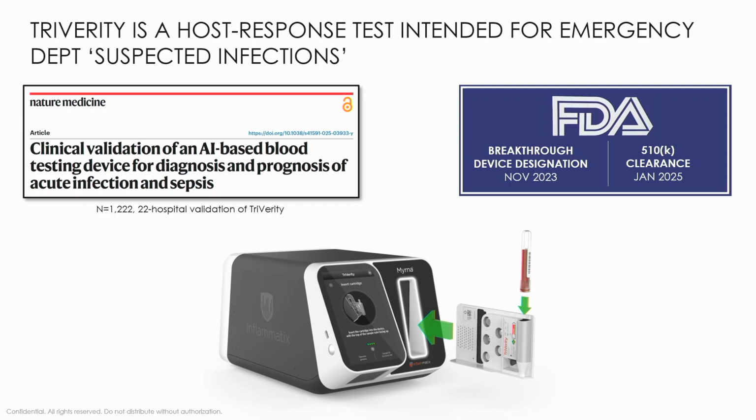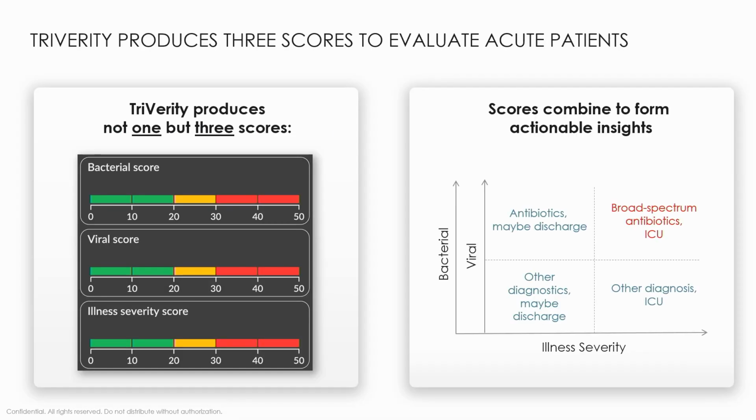You literally get a tube of blood, and it doesn't matter if it's contaminated or not, so we don't have to worry about tube contamination here. You literally take the tube, put it into the cartridge, and put it into the instrument. This is CLIA waivable, and this could potentially even be done in those micro hospitals, in those critical access hospitals where we may not have expert microbiologists available. So we can run this test fairly easily.